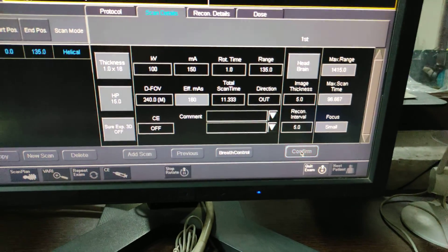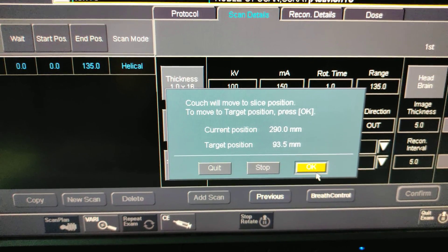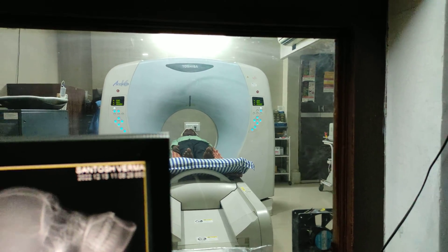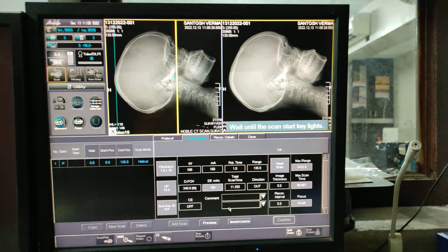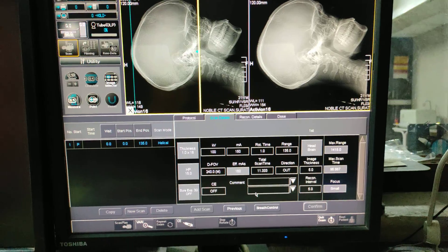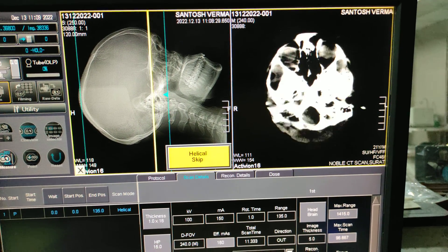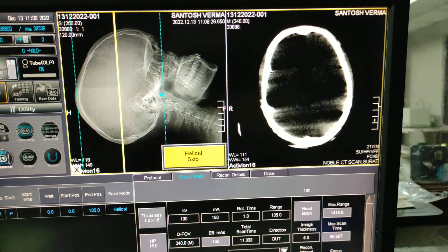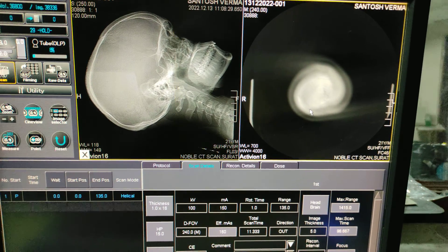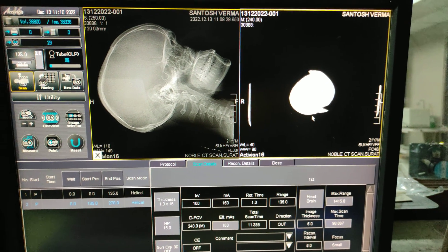Now we have to click on Confirm. The couch will move to the slice position — to move to the target position, press OK. The machine is moving to the scan area. Again wait until the scan key lights up, then press two times. Now this is our brain scan — slowly the images will appear on the screen.